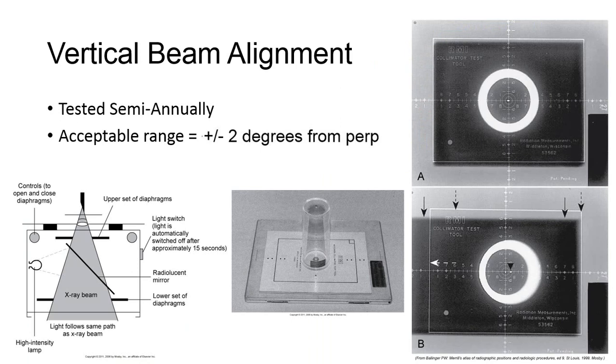As previously mentioned, this tool can be used for additional tests, like vertical beam alignment. When you set your x-ray tube to 0 degrees angulation, pointing straight down at the x-ray table, it should be perfectly perpendicular. This test, which is sometimes called beam perpendicularity test in some textbooks, determines if 0 degrees at the tube controls truly represents a beam with no angulation at the central ray.